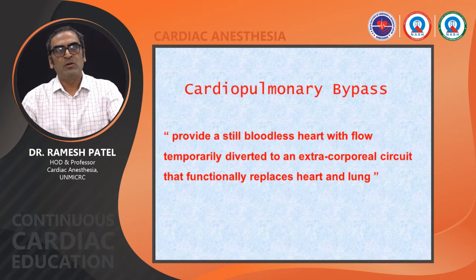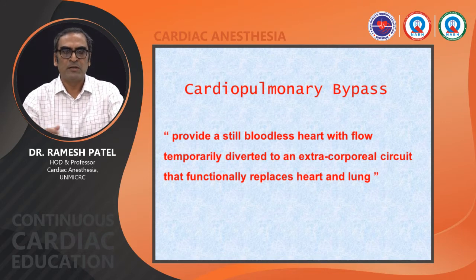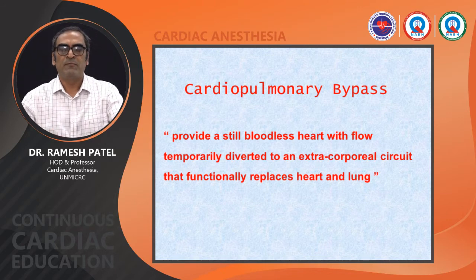In cardiac surgery, we all know that we need a bloodless and motionless field to work peacefully. So the whole volume of blood in the body is temporarily diverted to an extracorporeal circuit that functionally replaces the function of the heart as well as the lung.